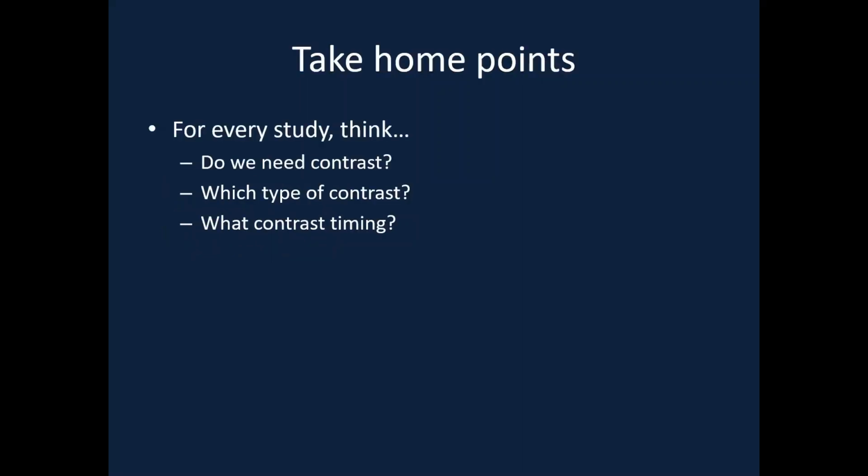The take-home points when thinking about abdominal CT protocoling is always think: do we need contrast? What type of contrast? And then what would be the best contrast timing?